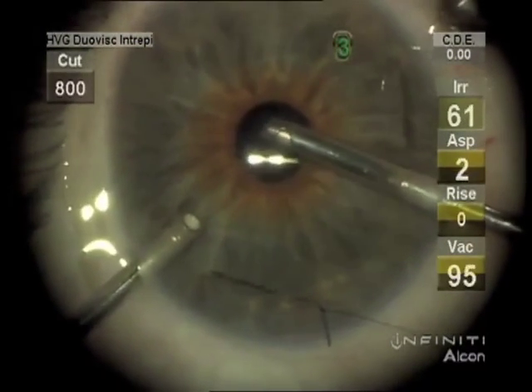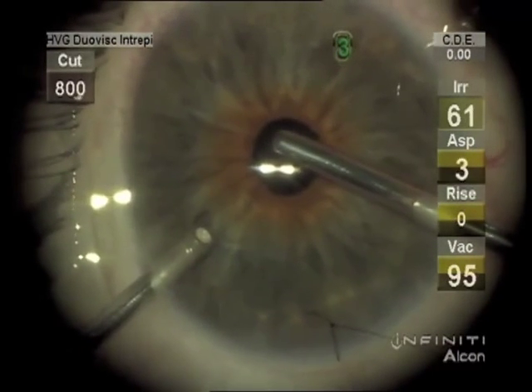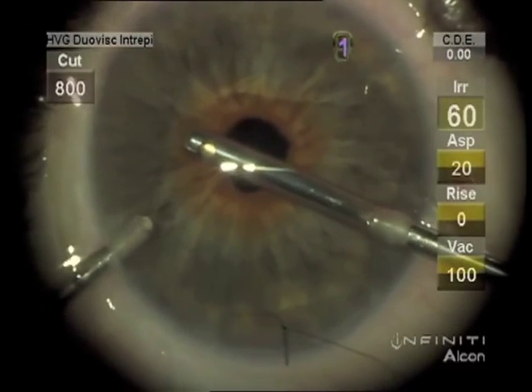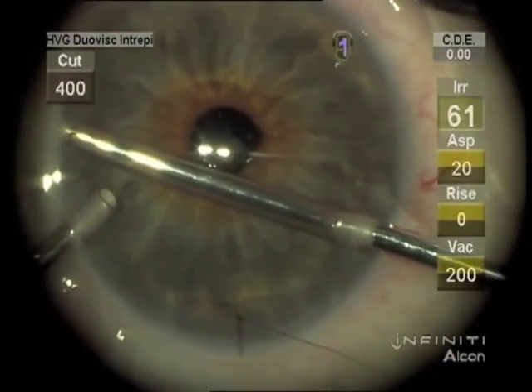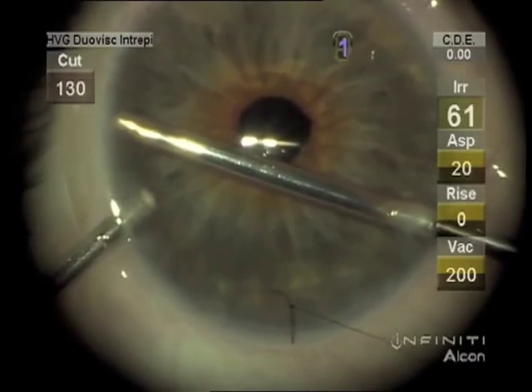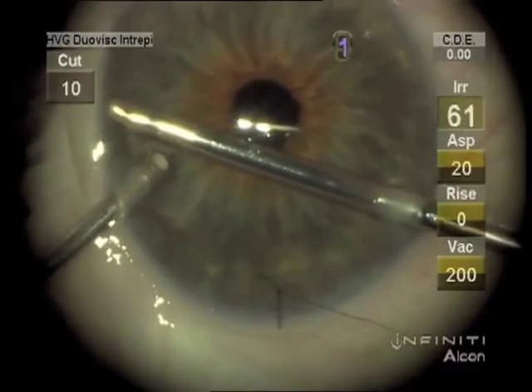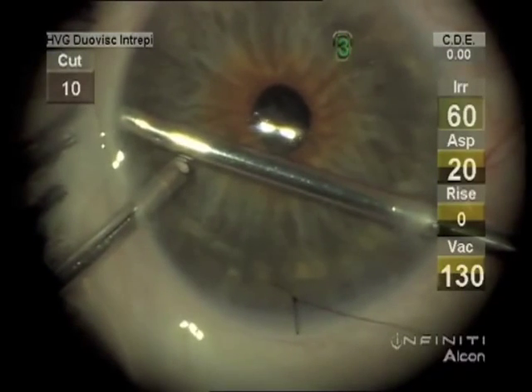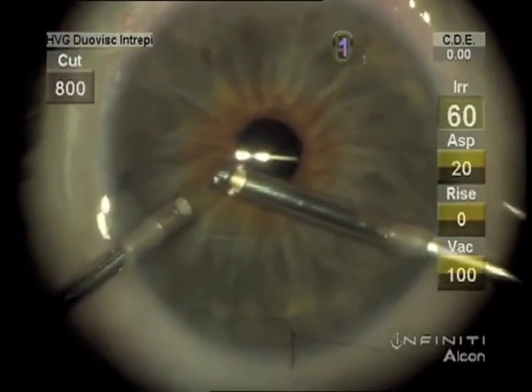So then we can use the miotic and make sure there isn't any vitreous herniation. It's two-port vitrectomy, and I use the vitrector on IA cut. You can see the cut rate being reduced to 10 per minute so that you can take just one aspiration cut to make the peripheral iridectomy.